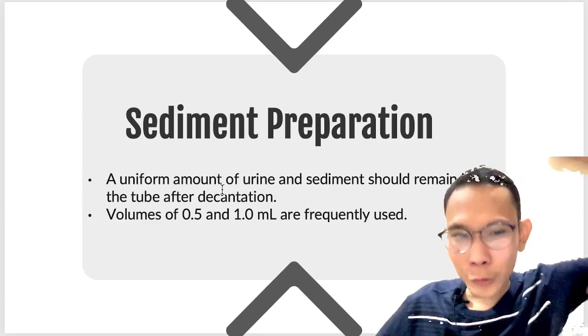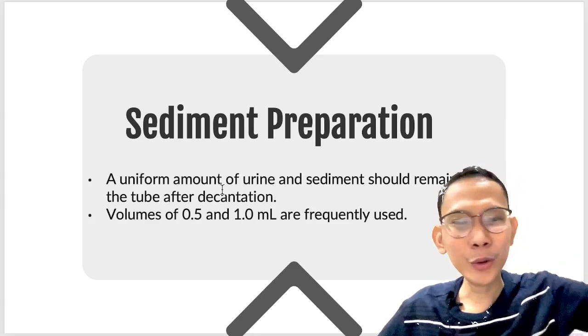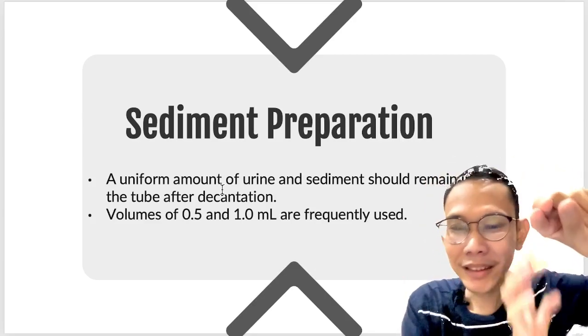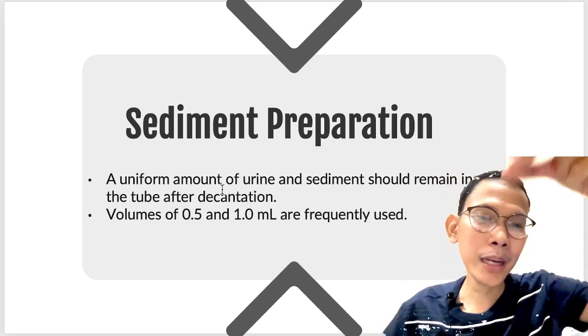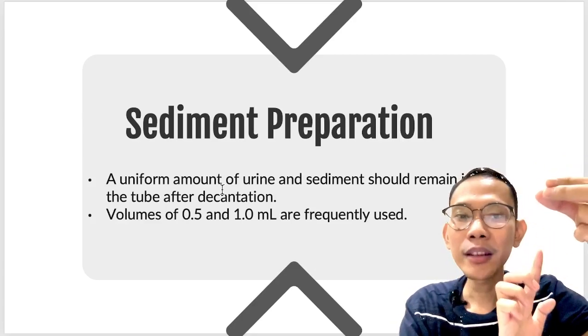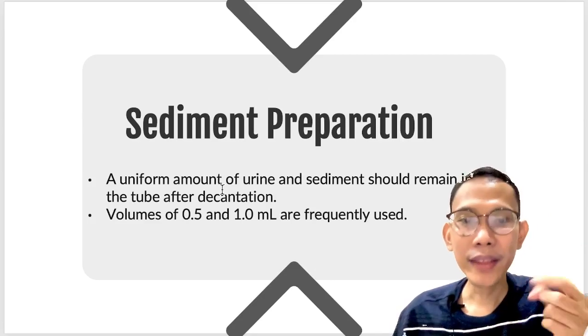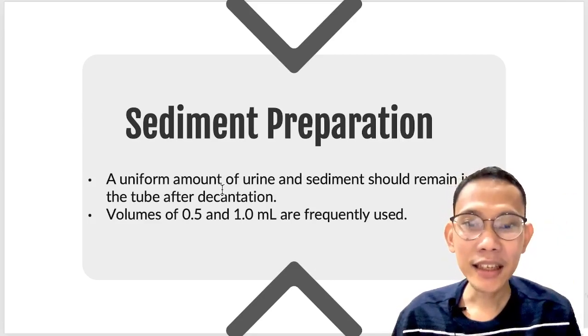Again, automatically, huwag kayong matakot. You just decant it. Kasi matatapon na talaga ng lahat. Do not worry, may matitira din. After a few seconds, ibalik mo yan. Then may matitira pa yan na supernatant. Then you mix that with the sediment. And then you flicker. Then yung lalagay sa ating glass slide.